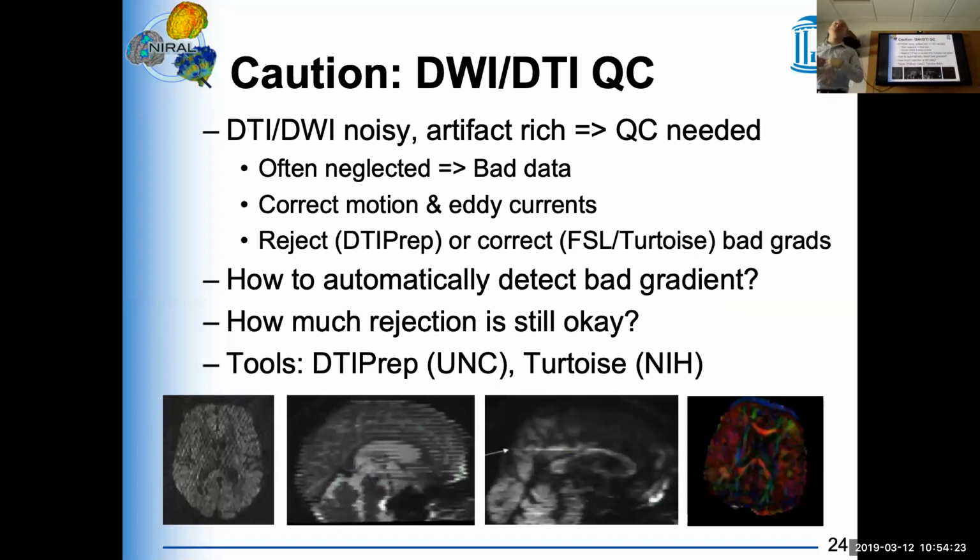Because of the correction process, it even looks rather artifact-free. Because of that correction, it's not going to look noisy. And because of that, you can sometimes get the impression that your data is good when underneath it is not that good. So it does also put out information on which areas are, so to say, error prone.